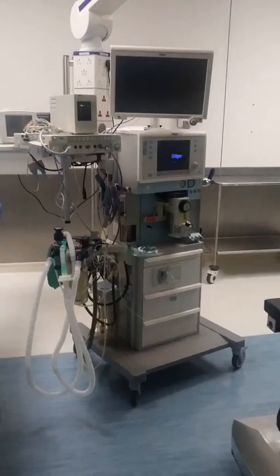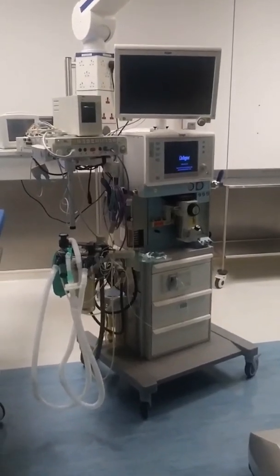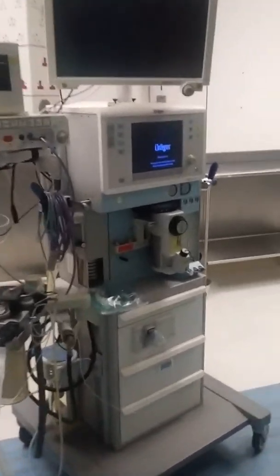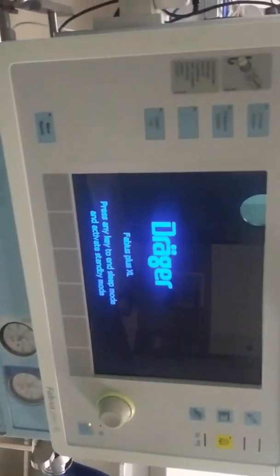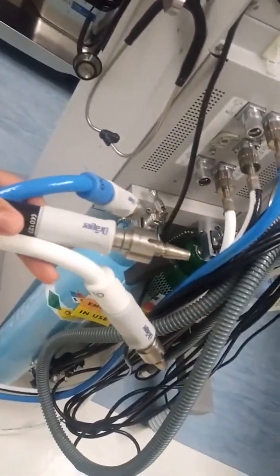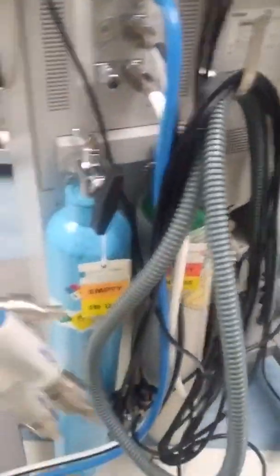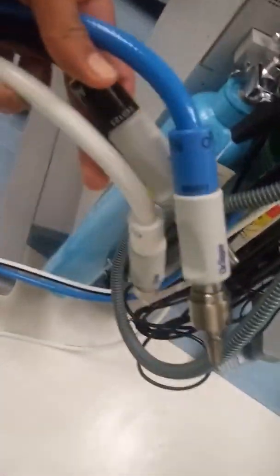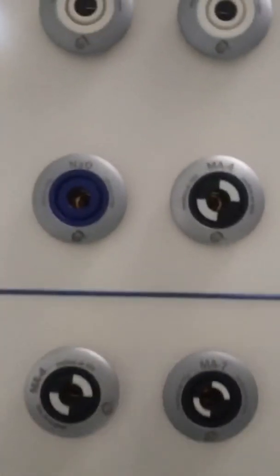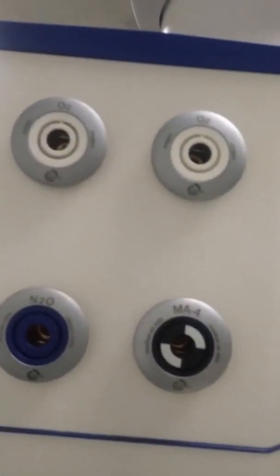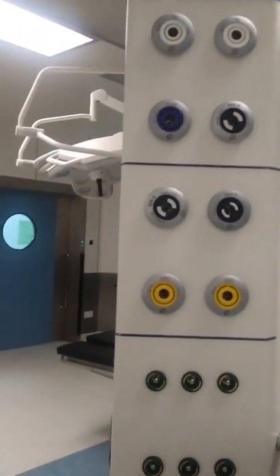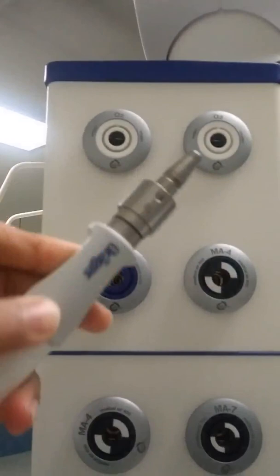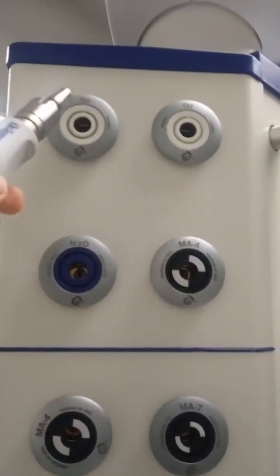Drager anesthesia workstation Fabius Plus Excel model combines quality integration with enhanced flexibility and integration capabilities. It delivers ICU-like performance without need for driving gas and acts as highly accurate piston ventilation. Today I am explaining the routine normal calibration checklist for Drager anesthesia workstation Fabius Plus Excel model. Please watch this video in full without skipping.